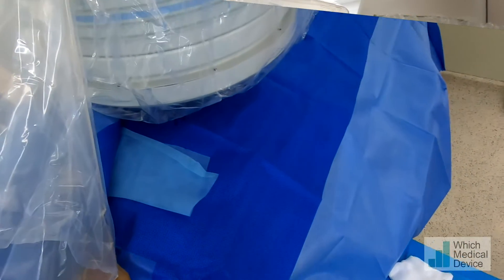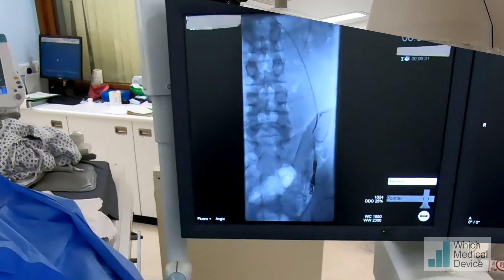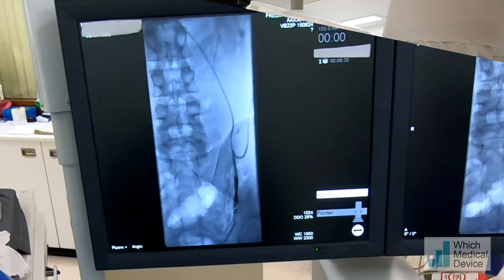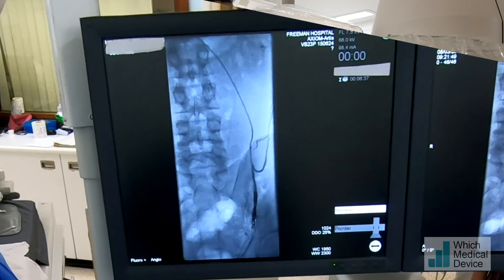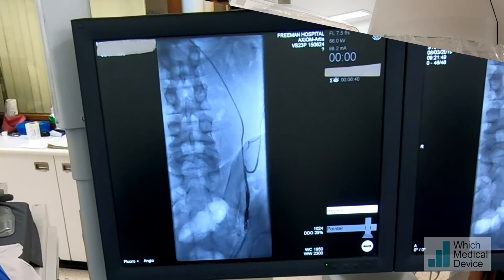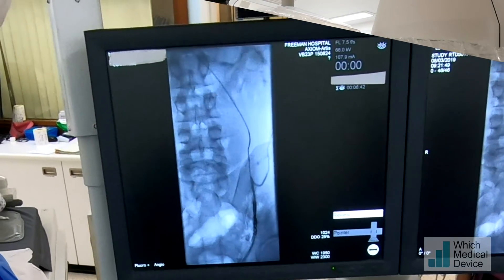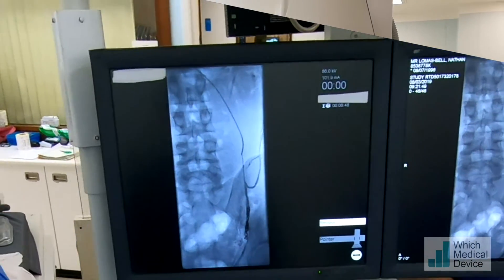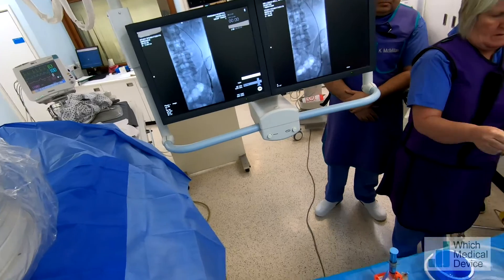I'm just going to check with a bit more contrast to look for any collateral vessels. We've seen that one there, but we've coiled below that, so that's good. The vein's gone into a lot of spasm here — you can see how small it is. So we're just going to place another 6mm coil up here for an extra measure. One coil is probably sufficient, but I often place two.